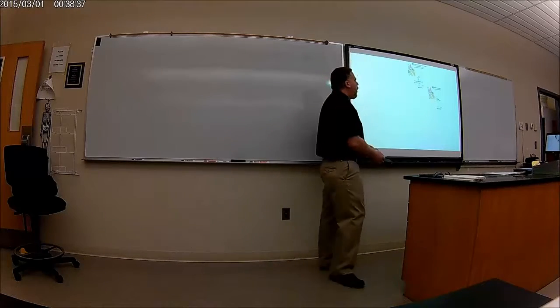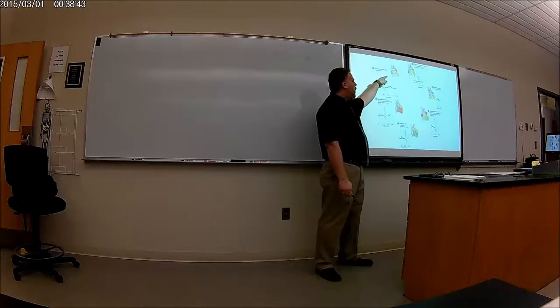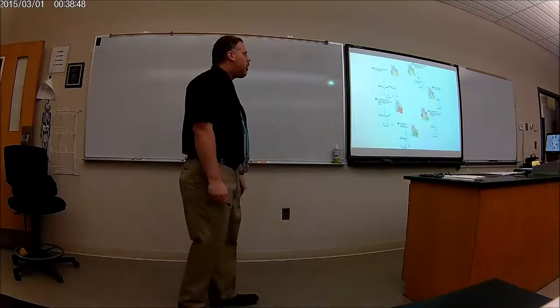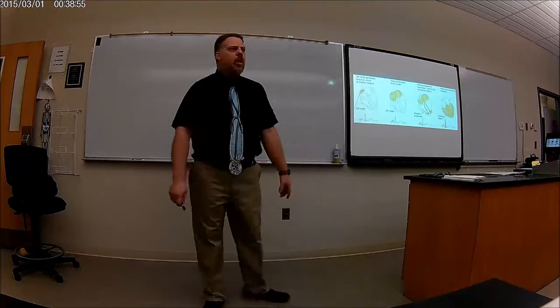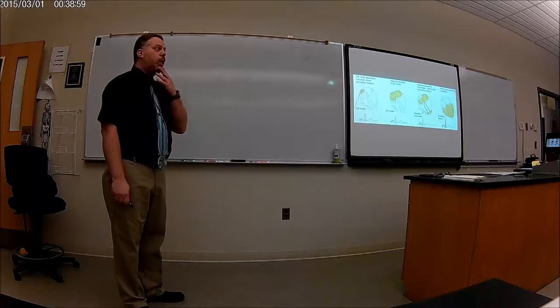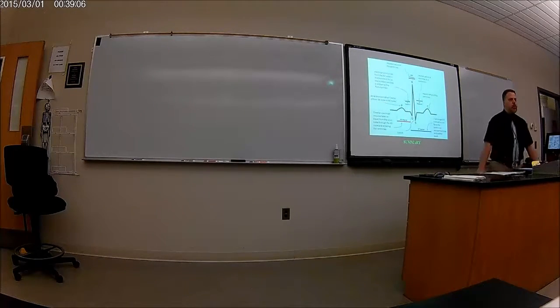All right, and here you can actually see another way where the P wave is, and it goes around this whole thing. You can do it that way if you want. What happens with the EKG and the heart. You can also see it this way in one picture form with the EKG and where the electrical impulse is. Big questions in at least the cardiac area of your lecture, okay? So this is just a summary of the parts of the EKG and what they do, okay?